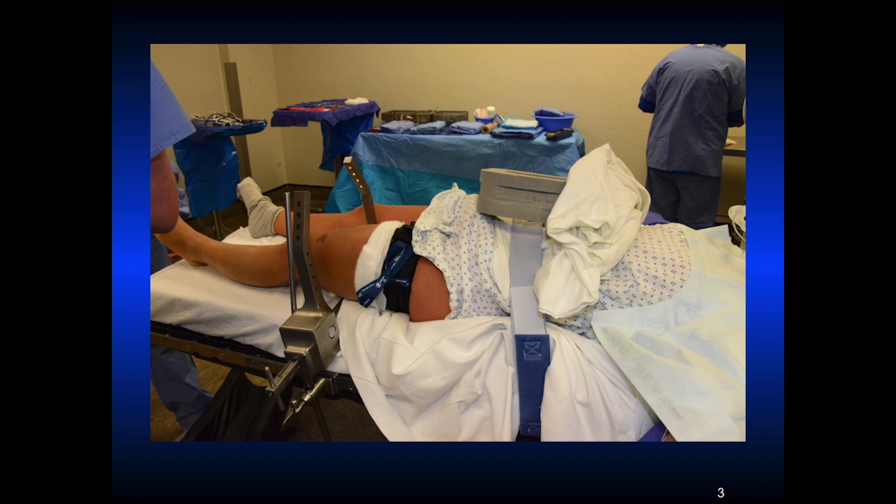So this is what it looks like. Basically you want the knee down — the top of the patella needs to be about five finger breadths below the leg holder. So oftentimes you have to adjust the position of the patient on the bed. The only reason to have it up higher with more room above the patella would be if you're removing multiple loose bodies or doing patellofemoral work.